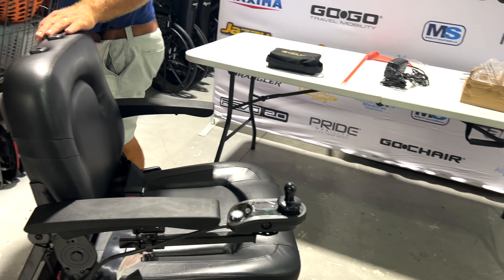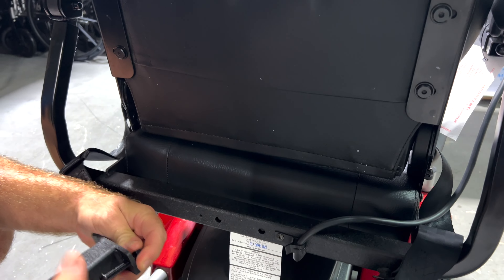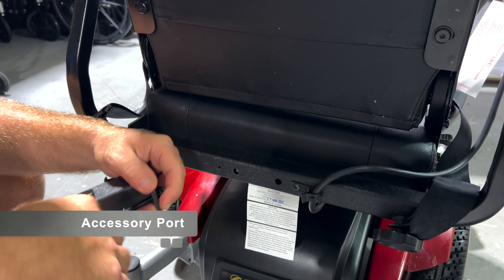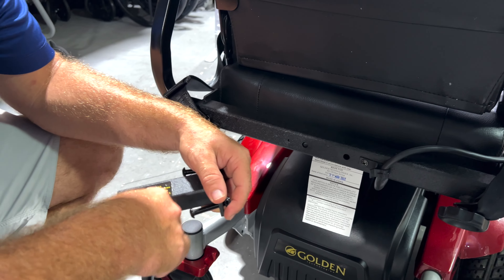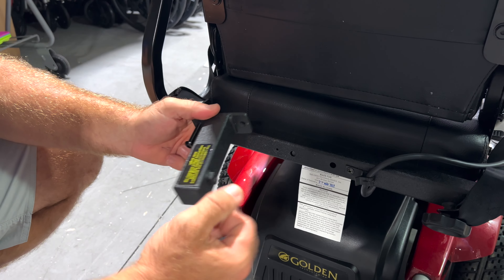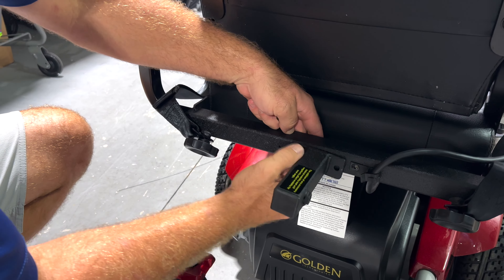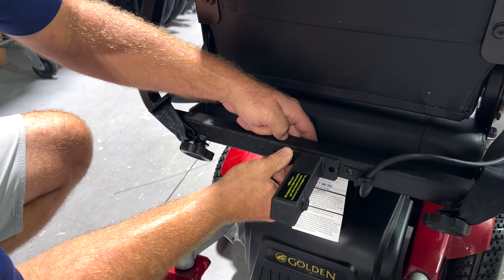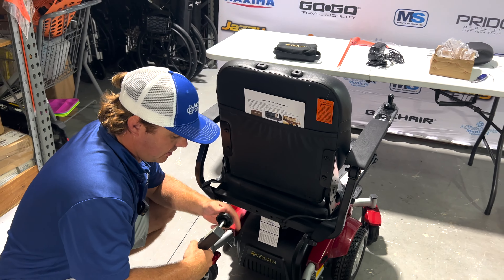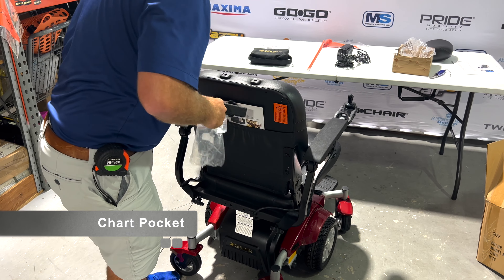This bar that I was speaking to you about will go right back here — you can roll that out. This is just the cap protector — you've got to pop that out. Use a flathead screwdriver, because you don't want to break your nails if you try to pull it out. You loosen this and it will go like so, and then you'll have a little wrench. You hold that and that's your receiver port — we'll put this on tomorrow. It just takes a little bit of time. Here's a little chart pocket back here — they call it a chart pocket. I'm just going to stick that right back in there.